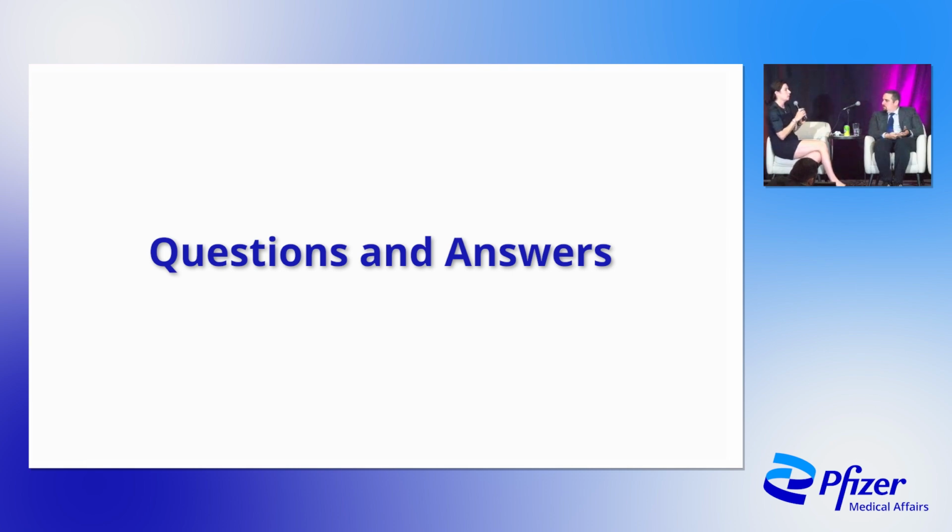Yeah, I agree with a lot of those points, maybe not so much about the grade 2 uptake. I consider grade 2 uptake diagnostic. I really just see patients who are referred with the concern of cardiac amyloidosis. I definitely see patients where I look at the echo and think, thick wall, perfect apical sparing pattern, it's not amyloid.